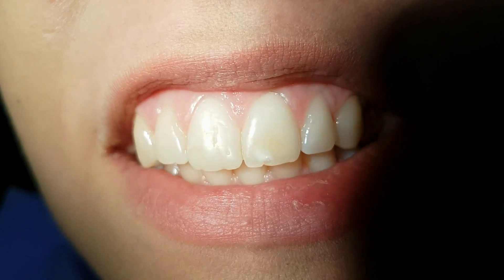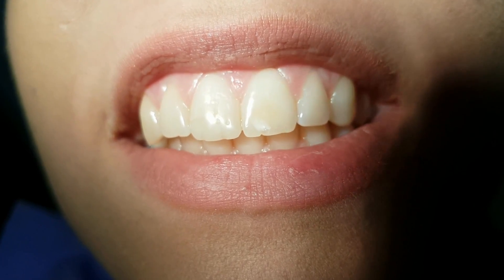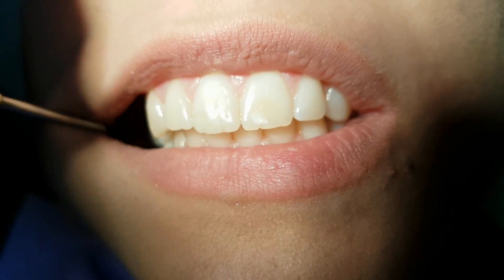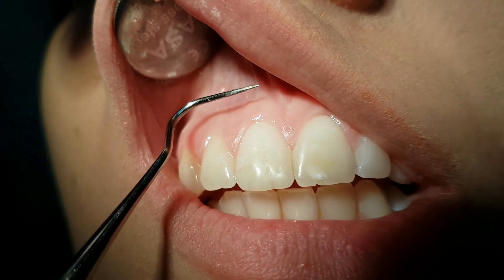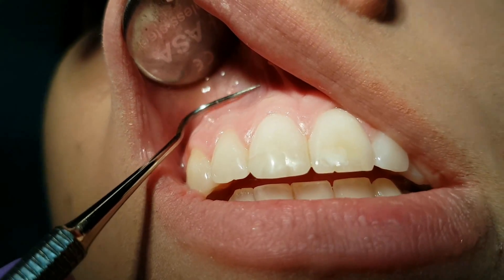In this video we will talk about local anesthesia in the upper jaw. This technique is also known as infiltrational, terminal, or plexus anesthesia. We apply the anesthetic several millimeters above the mucogingival junction in the alveolar mucosa.